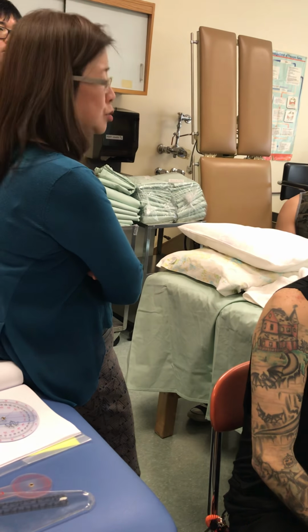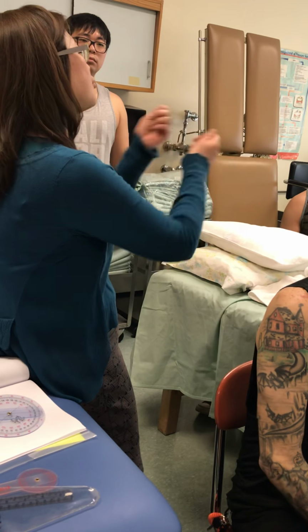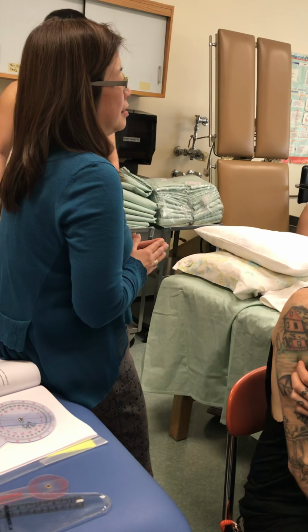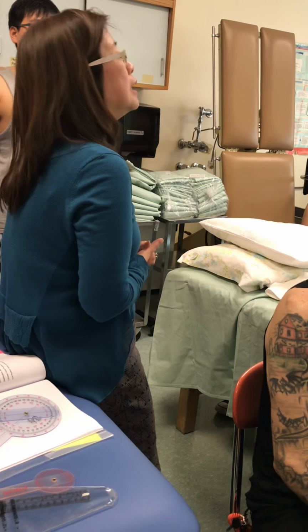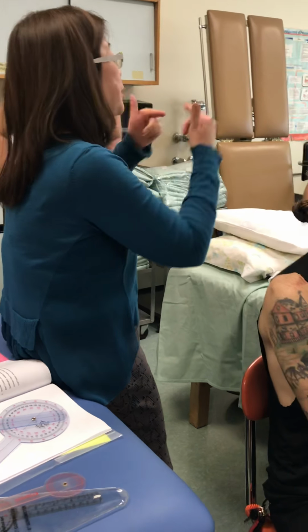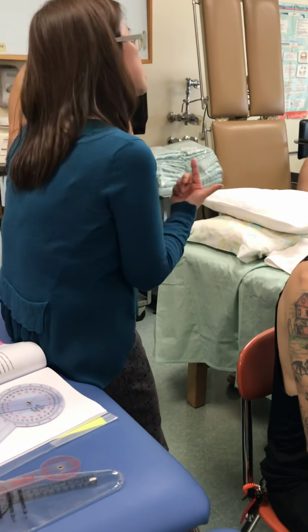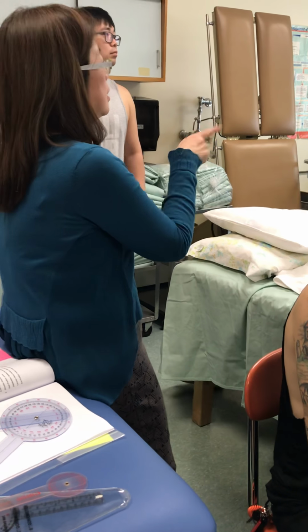A lot of times your goniometer gets in the way when you follow it, because if you don't move far enough away, they're going to do one of these things to get it up there. So you don't necessarily need to follow it. If it helps you keep an eye on the anatomical landmarks, especially the axis, because that's inside, then yes, follow it. Anything else? Go ahead.